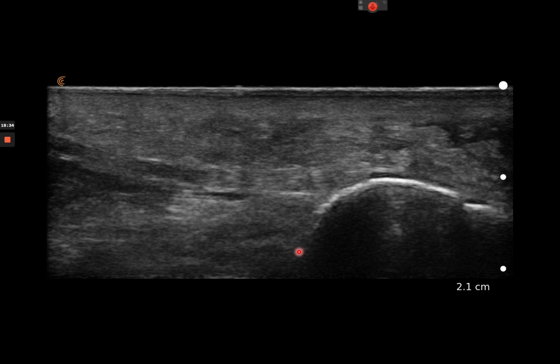So I have a look, and this woman comes in, and she's not weight bearing properly on that heel. She sort of limps into the room. When that happens, I'm usually thinking, okay, there's a plantar fascial tear. I scan her plantar fascia, and let's have a look here. So here's our calcaneus, and here's the plantar fascia inserting into that, and here's our fat pad up here. How do we think this looks? Does this look normal or abnormal?